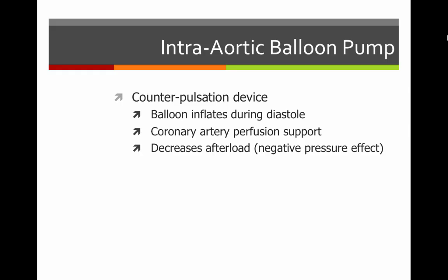Now let's transition to a little bit of critical care and hospital-based interventions. First one we'll talk about is the intra-aortic balloon pump. This is a counterpulsation device. This balloon is inserted into a patient's aorta and inflates during diastole. That'll give your patient's failing heart some coronary artery perfusion support.